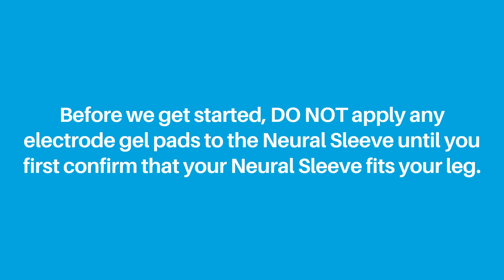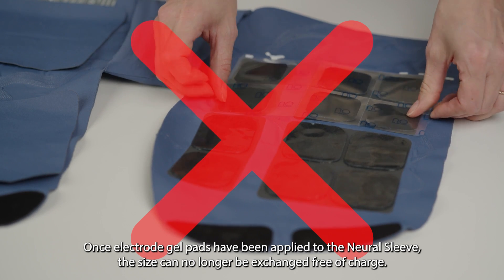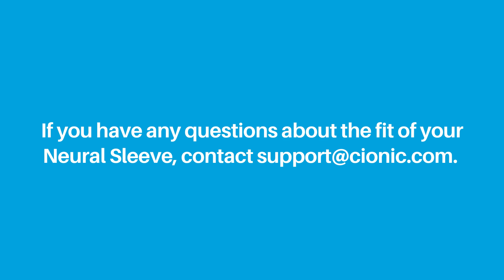Applying electrode gel pads. Before we get started, remember: do not apply any electrode gel pads to the Neural Sleeve until you first confirm that your Neural Sleeve fits your leg. Once electrode gel pads have been applied to the Neural Sleeve, the size can no longer be exchanged free of charge. If you have any questions about the fit of your Neural Sleeve, contact support at psionic.com.